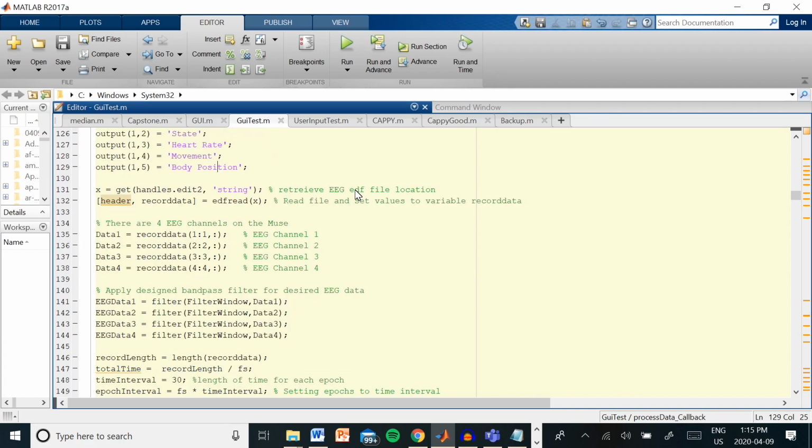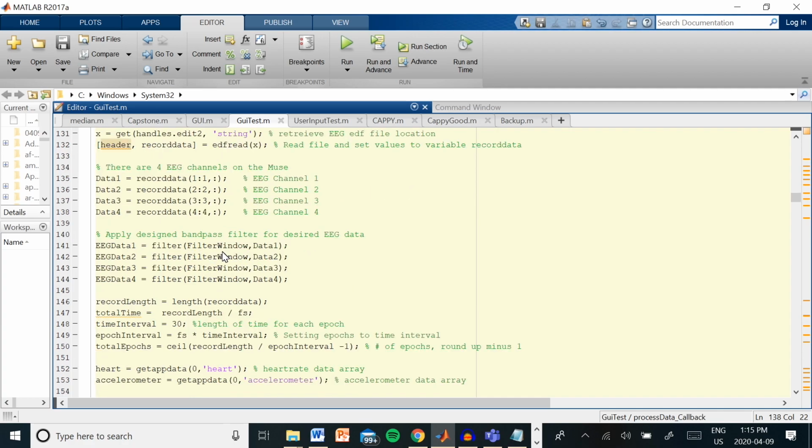We start by reading the EDF file, which contains 4 channels of EEG data that was just recorded using the Muse. We take the raw data from the channels and apply a bandpass filter to remove any unwanted frequencies.